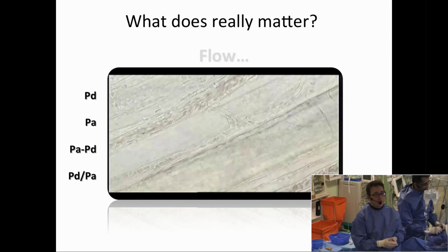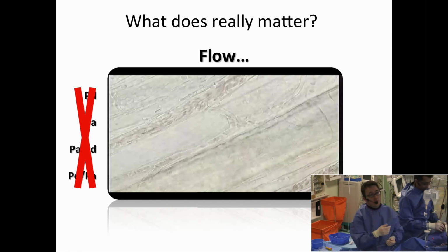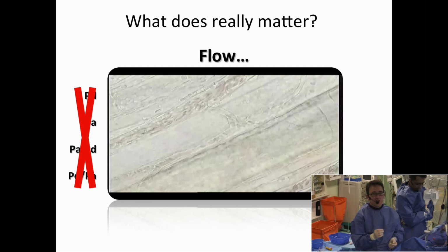And if we move on, you'll see that, of course, the thing we are really trying to measure here is blood flow. And maybe this video will play for us. You'll see as we play, or perhaps it won't today, but the video essentially shows us that these are small little cells moving through very, very small micro channels within the myocardium. And you can see all of the surrogates that we're trying to measure are essentially related to blood flow. So all these pressure changes we try and measure are essentially related to flow.